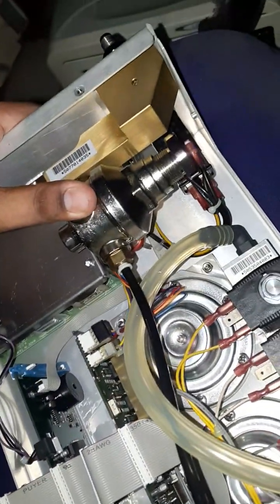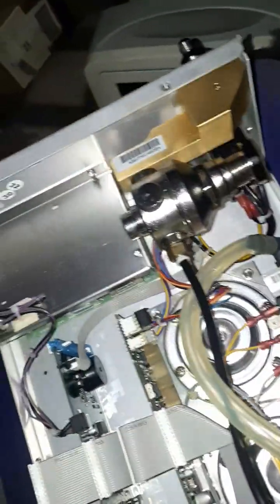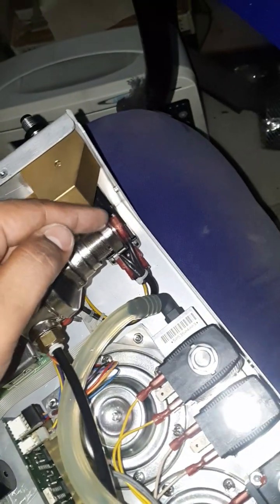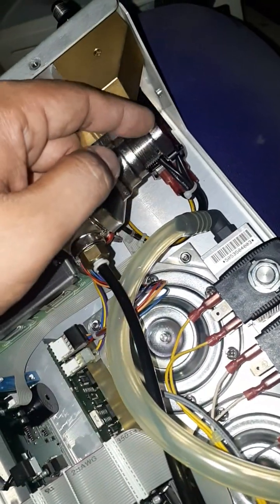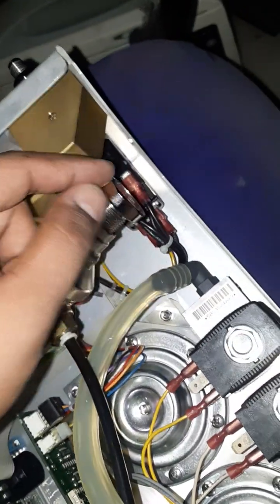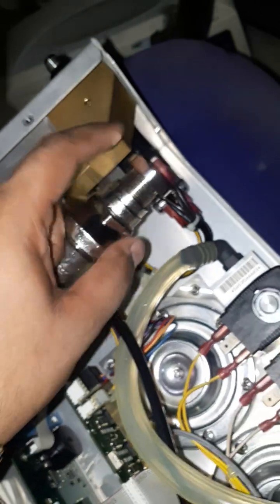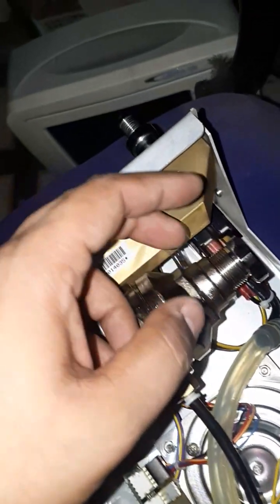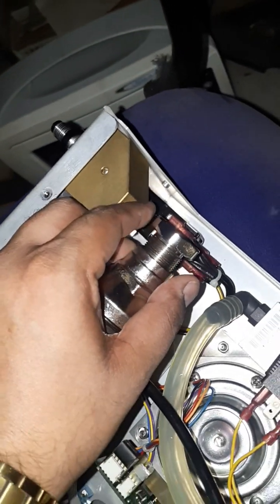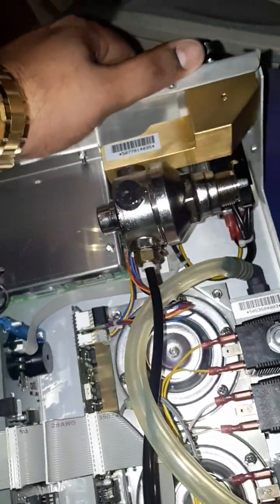If you set a wrong pressure range, then your insuflator will give you alarms. Then always, before rotating anything, mark the nut with a black permanent marker with the same line on that body and on that nut. After that, after rotating or after working for 5 or 10 minutes, if you did anything wrong in this insuflator, then you have the option to reverse or reset the position of the knob to its actual position. So those are the safety precautions I told you.